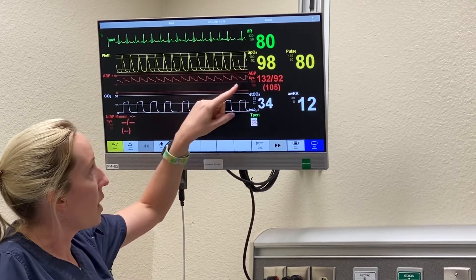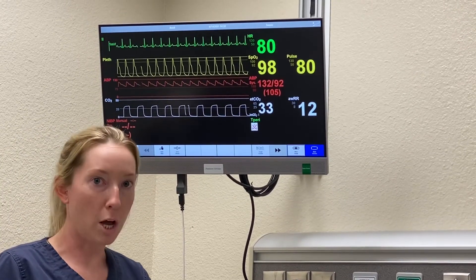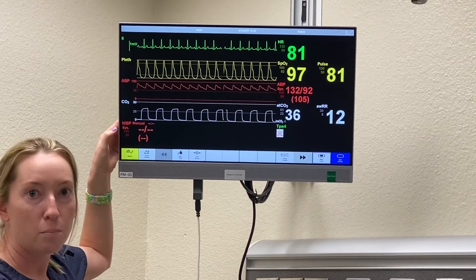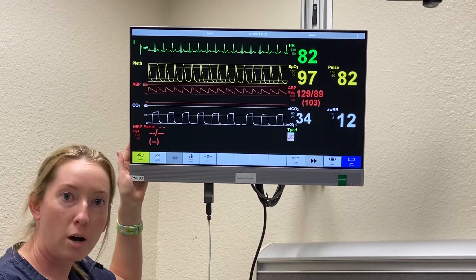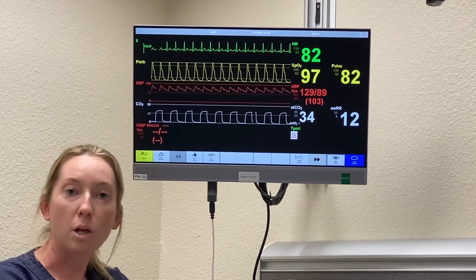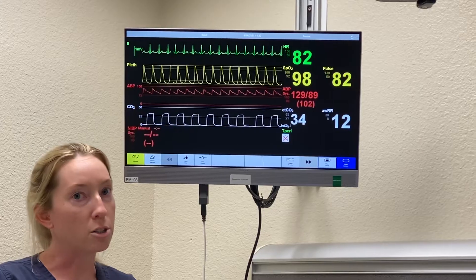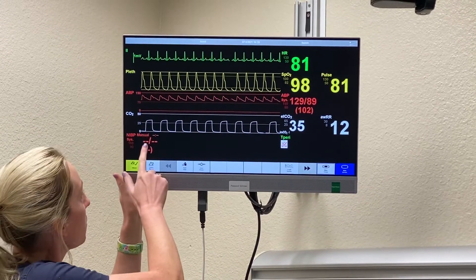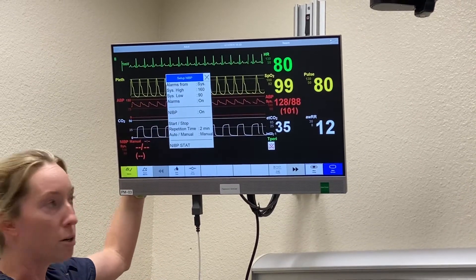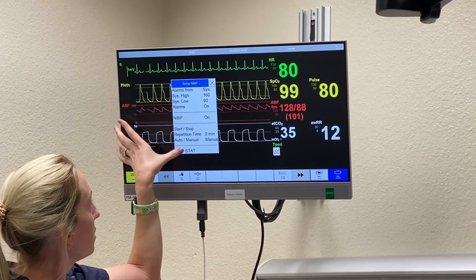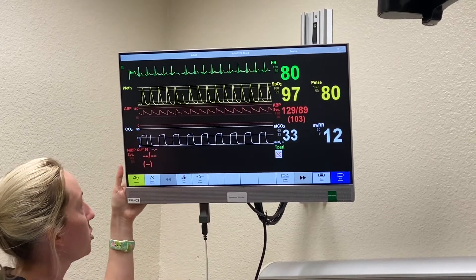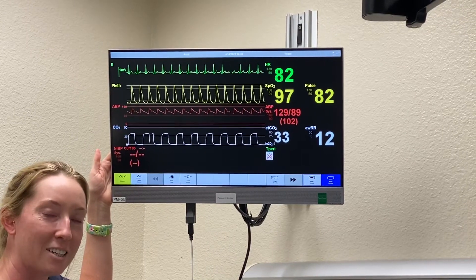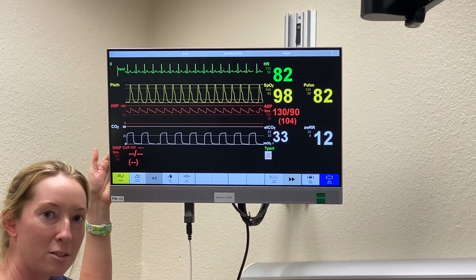Next we have ABP — that is your arterial blood pressure. Down here we have NIBP, that is non-invasive blood pressure. So that's a blood pressure cuff versus an arterial line, which would be a small catheter placed in an artery. On our monitors, we can start and stop our blood pressures, and it'll read as a regular vital signs monitor would.